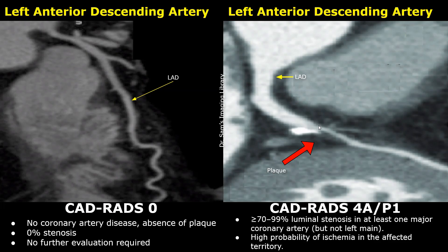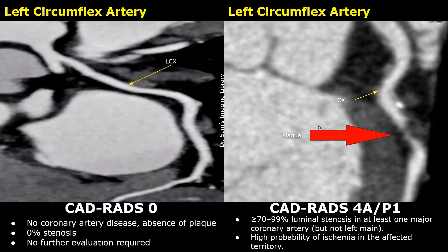This plaque is present in the left circumflex artery. The stenosis seems to be between 70% and 99%. This was a CADRADS-4A P1 lesion.